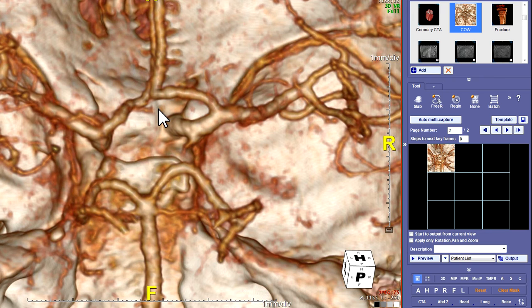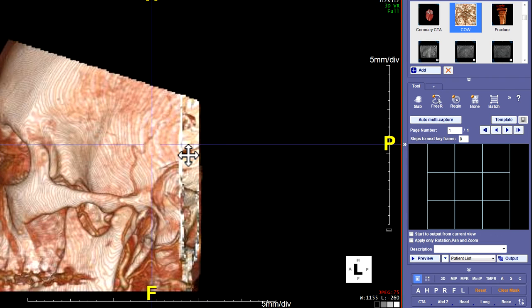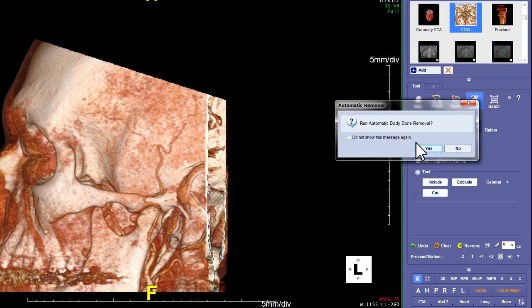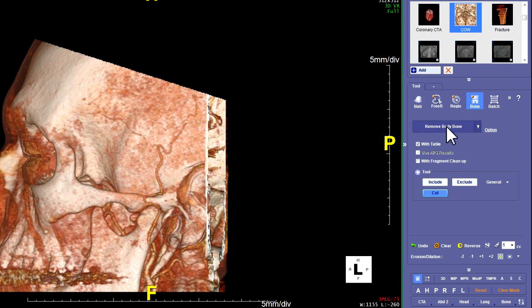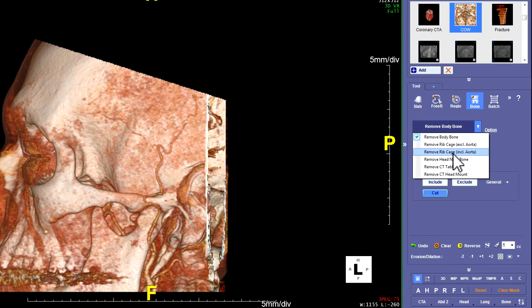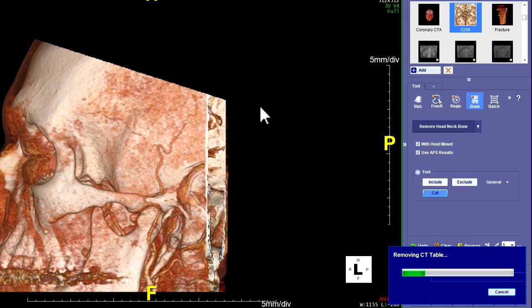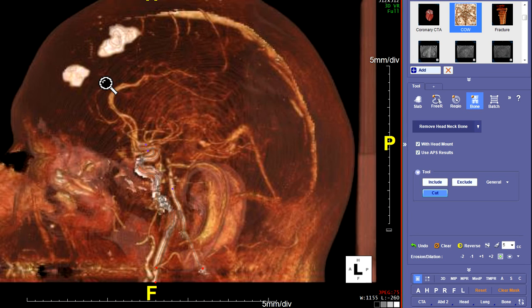Now we're going to use this data set and make the 3D CAL minus bone. Go to a left view and shrink it down a little bit. Click the bone removal tool — it will bring up a window asking if you want to run the automatic bone removal. Say no, because this is head and neck, not body, and running automatic body bone removal will mess it up. That gives you an extra tab that says Remove Body Bone. Use the arrow and go down to Remove Head and Neck Bone — that's a little trick you have to do. Click it, and the head and neck bone will be removed.